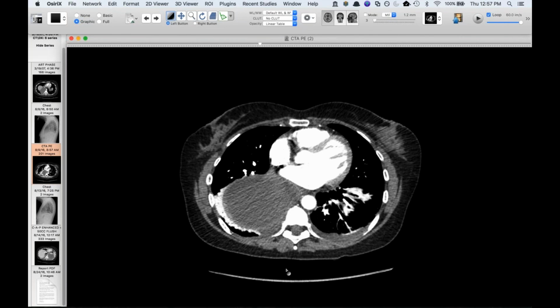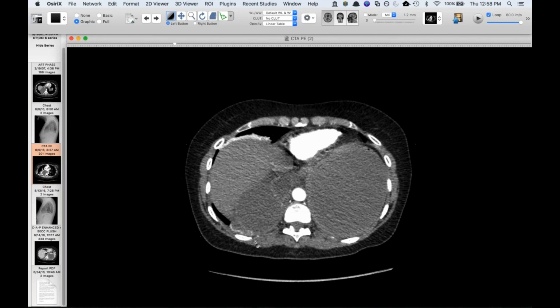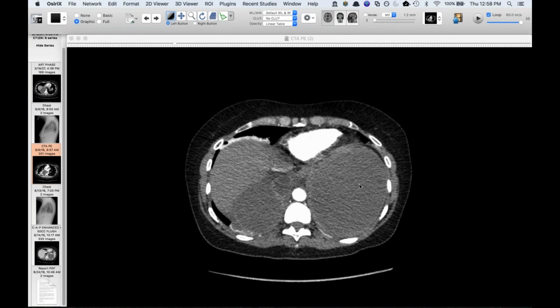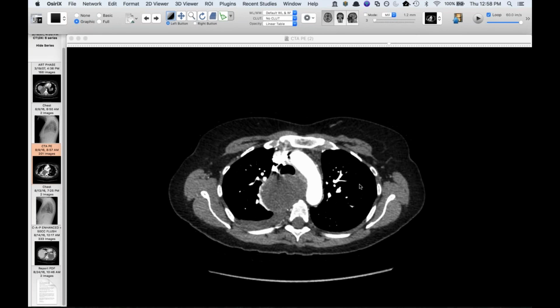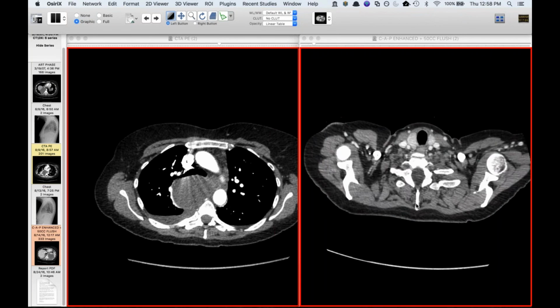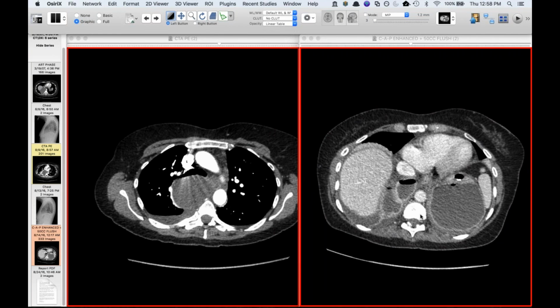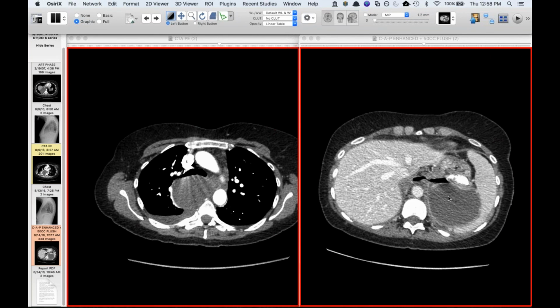Of course, she doesn't have a PE, but on this early phase, you may even hallucinate a little bit of wall thickening in this thing, but especially the intra-abdominal component has enlarged. But she had chest pain. I think they gave her antibiotics or something and sent her home, and then she came back that weekend. So this is the CT I saw, and now you can see that this thing is containing an air fluid level. You can definitely see there's enhancement in wall thickening, and there's air throughout it.